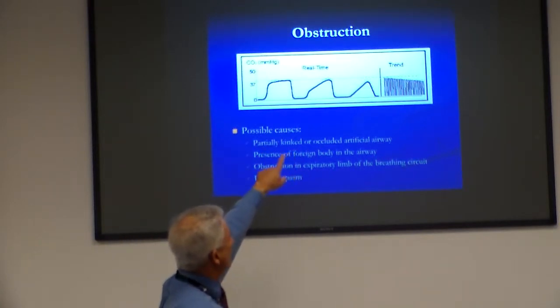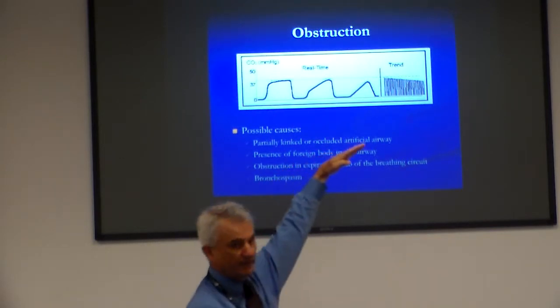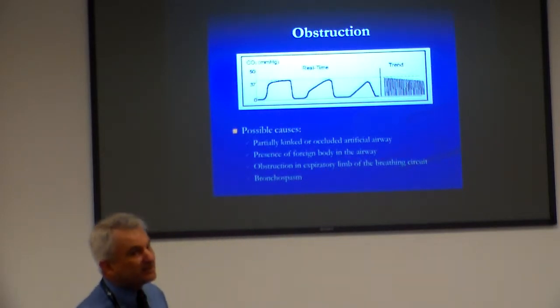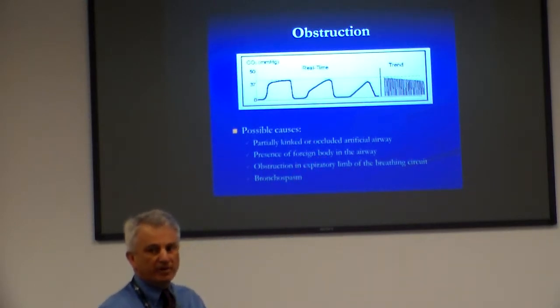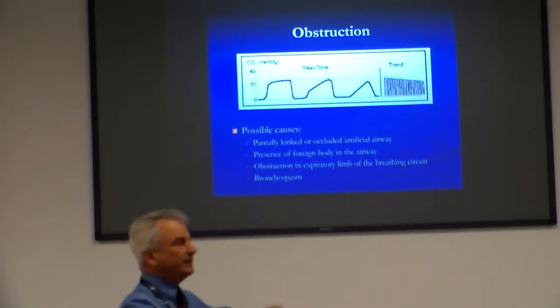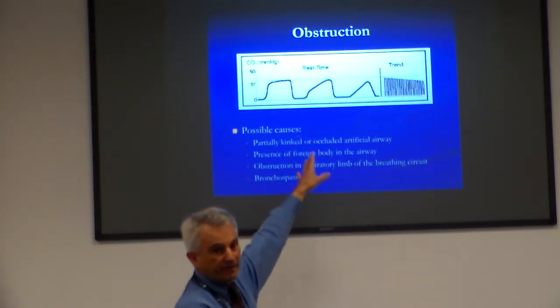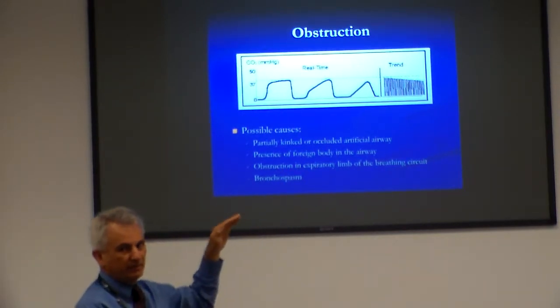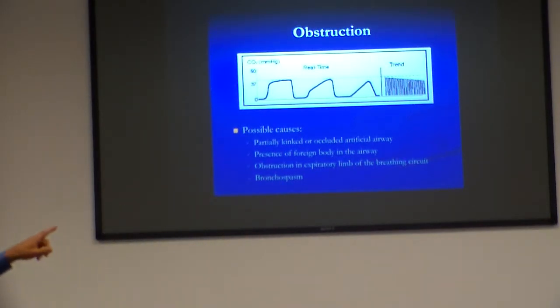The next one, again, this is trying to get the CO2 out, all right? It gives you the shark fin, kind of, instead of the orca. It's very sloping up because I'm trying to get that CO2 out, I'm trying to get it out, and finally, only really near the end, the high concentration of CO2 from way down in the alveoli finally gets out, and we get that peak. This is the one, as EMS professionals, we better be able to recognize. That kind of slope is the one that will kill your young patients. We better recognize the shark fin. That's the one you want to be looking out for.